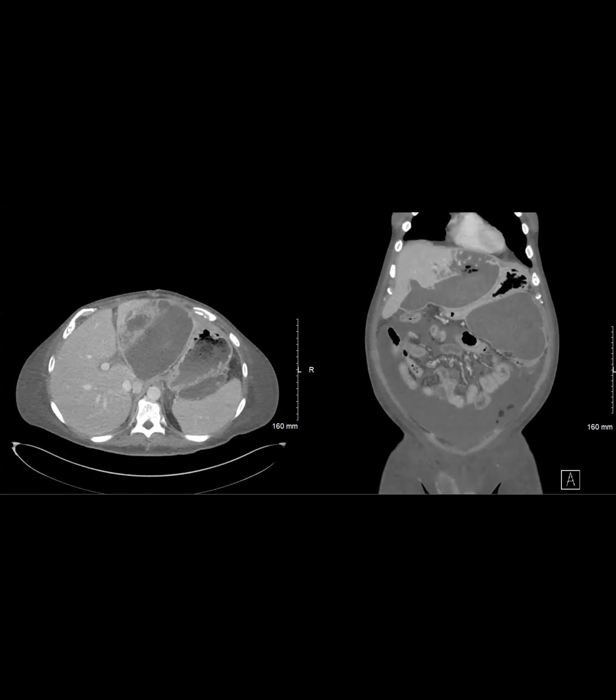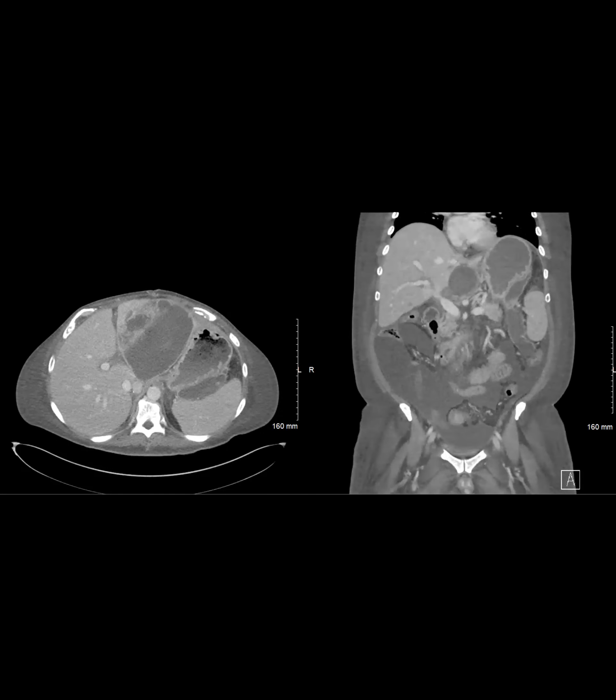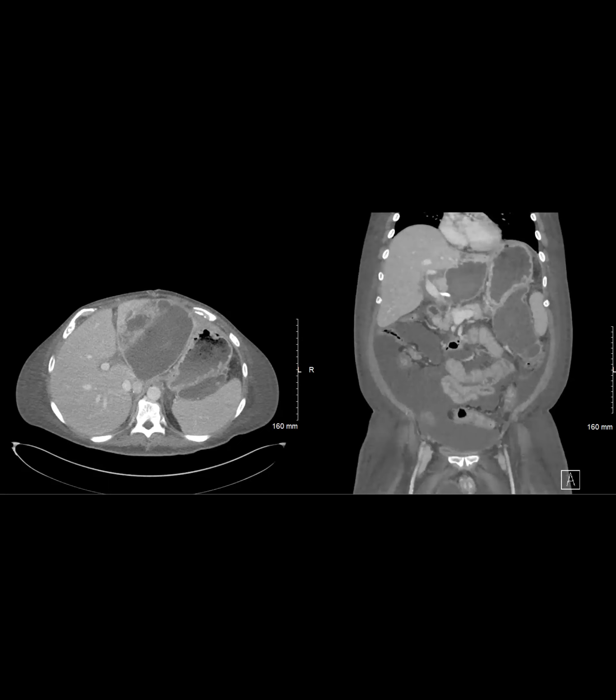And what did they embolize? Which vessel? Good question. Let me double check. I saw some coils maybe in the region of the hepatic artery. He has a transplant presenting with abdominal bleed, so we didn't have a cross-sectional study on that. Impression: successful covered stenting of the proper hepatic artery to exclude a 2.5 centimeter pseudoaneurysm, likely arising from the arterial anastomosis. So they covered the proper hepatic artery. Got it. That makes sense then, because they could have knocked off an early branch to the left lateral sector. Yeah, and there's no pre-embolization cross-sectional imaging. The next imaging after the embolization is what I'm showing you right now.